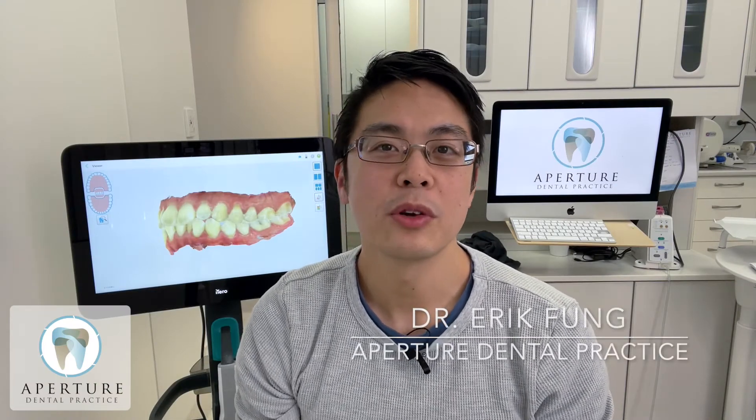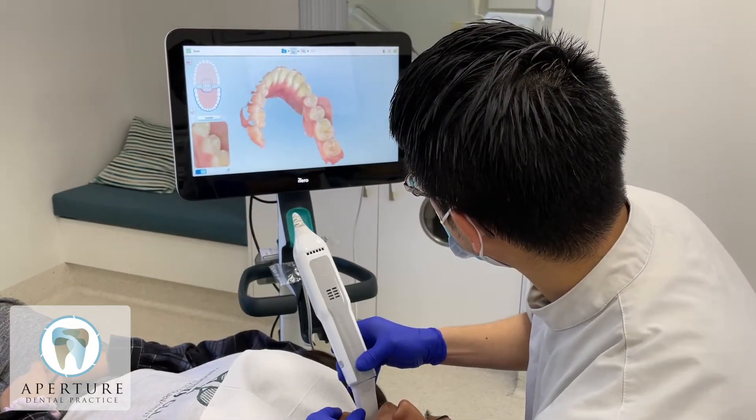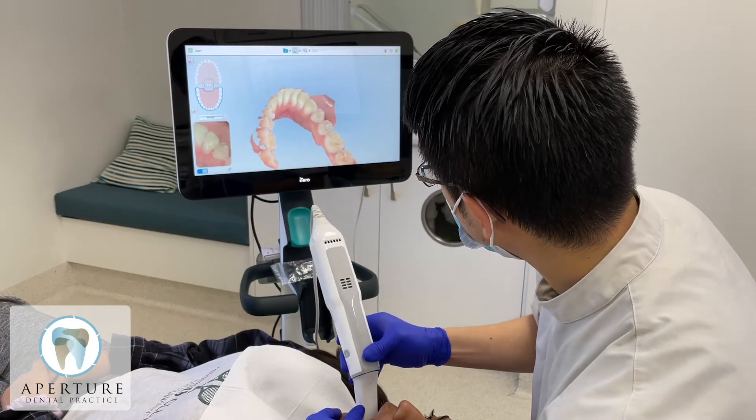Hi everyone, I'm Dr. Eric from Aperture Dental Practice. Today I'll be talking to you about how the iTero scanner helps seamlessly get your Invisalign treatment started. The iTero scanner is integrated into Invisalign because they are both designed by the same company called Align Tech, so they work very well together.